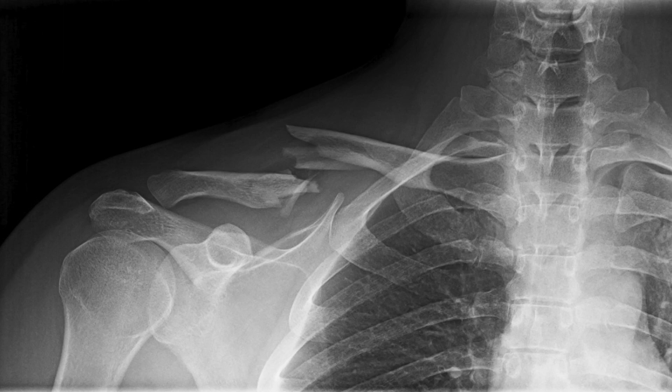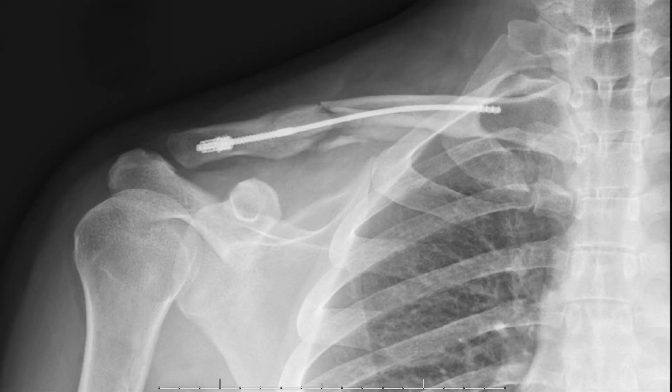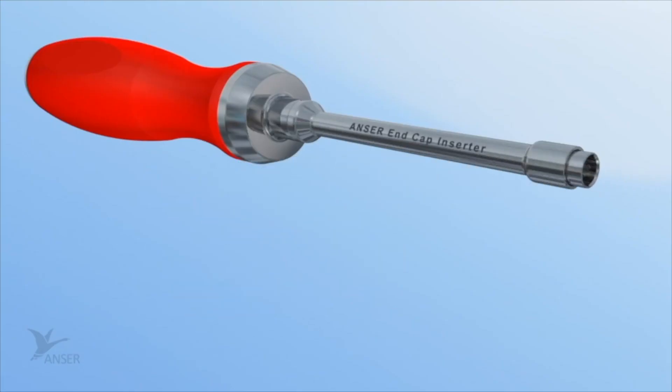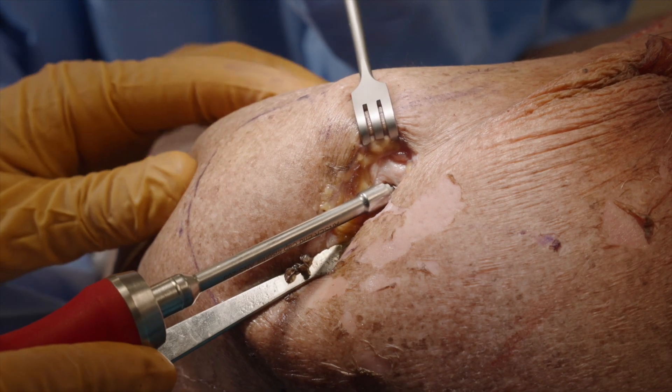Approximate and reduce fracture elements in the setting of a comminuted fracture as best as possible to generate a good indication of the appropriate length. Tip: in case of a comminuted fracture, a circling suture with number one Vicryl or Vicryl tape can be considered to obtain and maintain bone apposition. Make sure the resilient legs of the Anser lateral fixation device are still placed in one of the indentations of the Anser clavicle pin. When aligned and deemed at length, place the Anser end cap using the Anser end cap inserter. Advance the Anser end cap until a click is felt and/or heard.